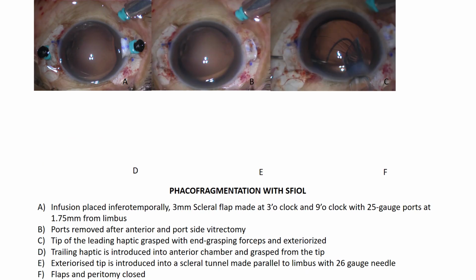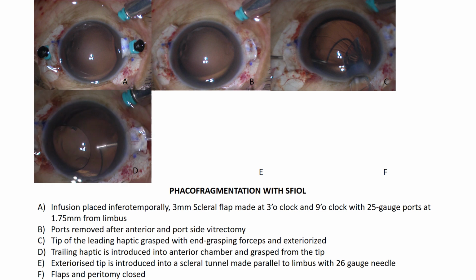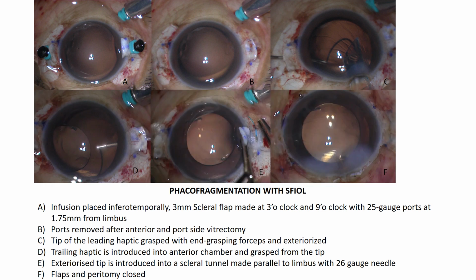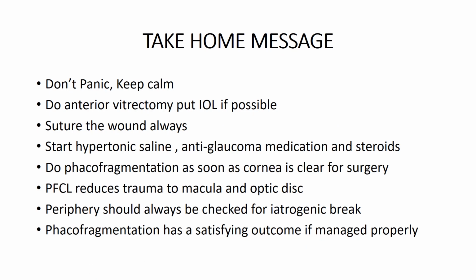After phacofragmentation, SFIOL can also be done by using the same ports and trying to remove the haptics from the ports itself and tucking them in.